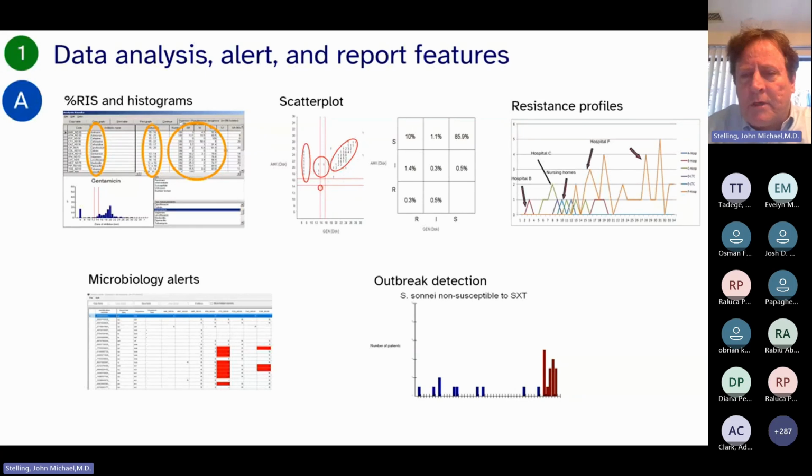So a few conclusions. Yes, both drugs are very good. 86%, both drugs will work. 10% amikacin is better. It's 10% better microbiologically. 10% of these bacteria, the amikacin should work, but the gentamicin would not. So a correct conclusion is that amikacin has better microbiological efficacy. An incorrect conclusion is that amikacin is better, therefore we should always use amikacin instead of gentamicin.